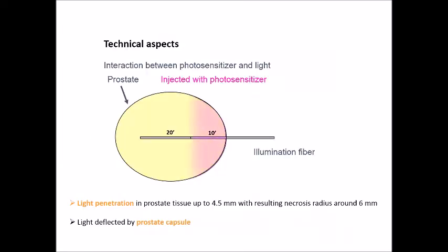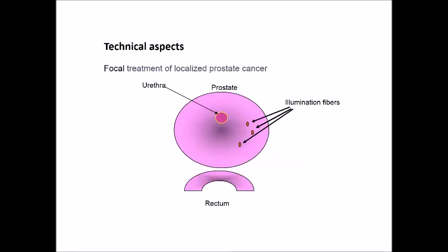Once all the fibers are in place, the light is dimmed in the operating room. The photosensitizer is injected during 10 minutes and then the laser light activated for 22 minutes and 15 seconds. On a transversal view, the activation of the laser fiber produces a vaso-occlusive effect that will lead to a complete necrosis of the targeted volume in a few hours.